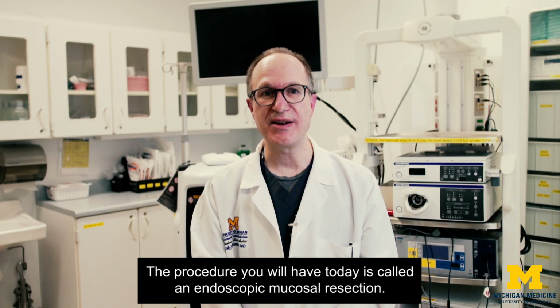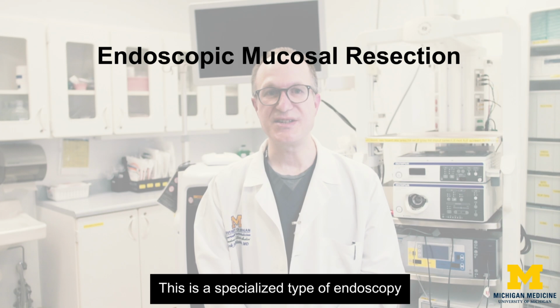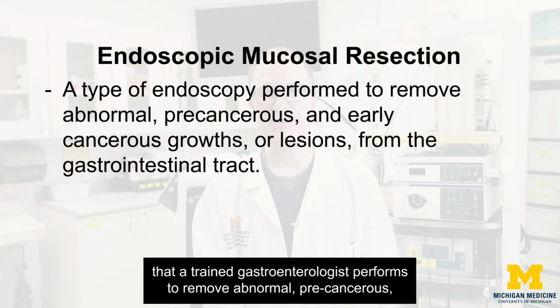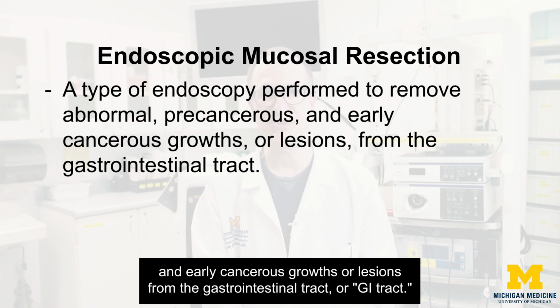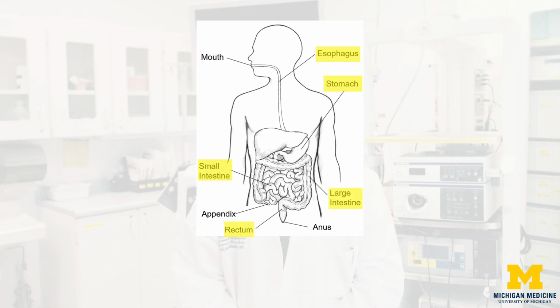The procedure you will have today is called endoscopic mucosal resection. This is a specialized type of endoscopy that a trained gastroenterologist performs to remove abnormal, precancerous, and early cancerous growths or lesions from the gastrointestinal tract, or GI tract. The GI tract includes the esophagus, stomach, small intestine, large intestine, and rectum.